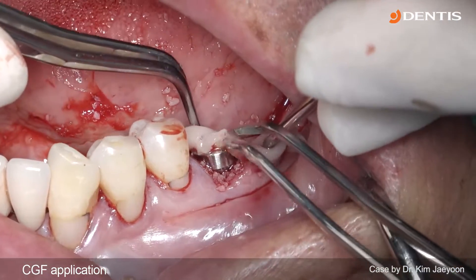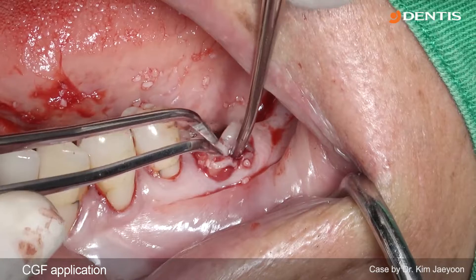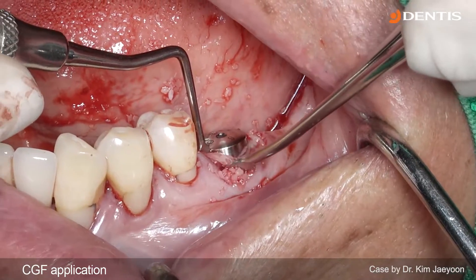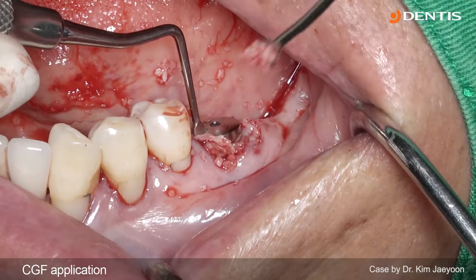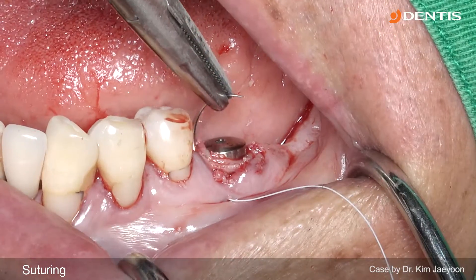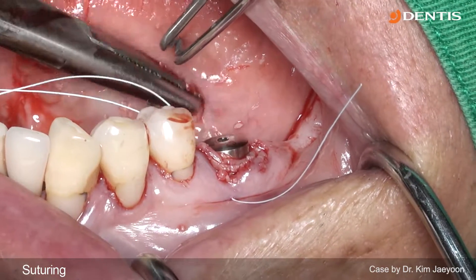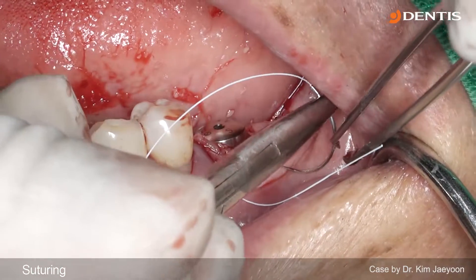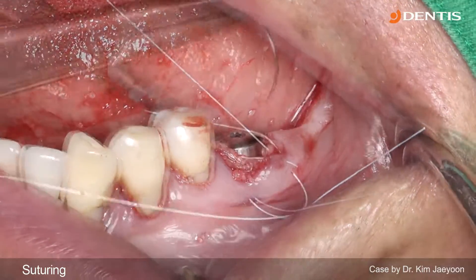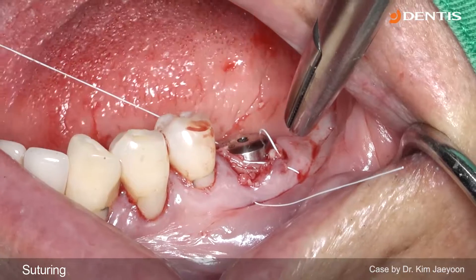This is the CGF membrane made from the patient's blood. Alternatively, you can use a collagen membrane or collagen tape. I use a figure-of-8 suture to more closely adapt the flap to the healing abutment. In immediate implant placement, you don't have to fully close the flap — just adapt the flap closer. That's all.